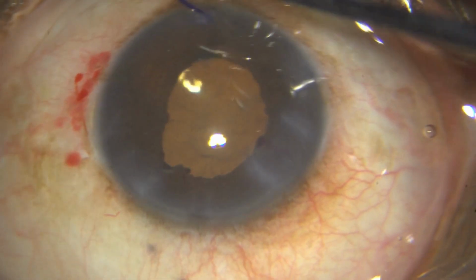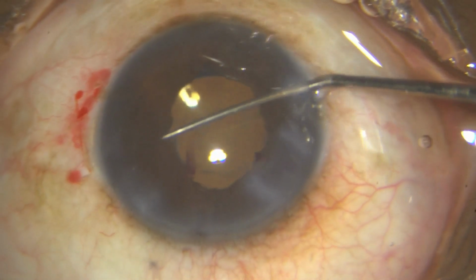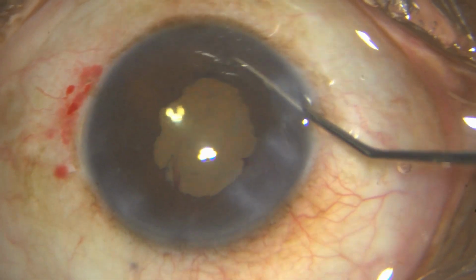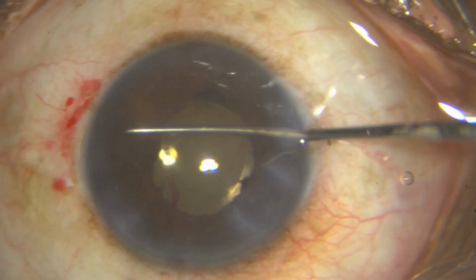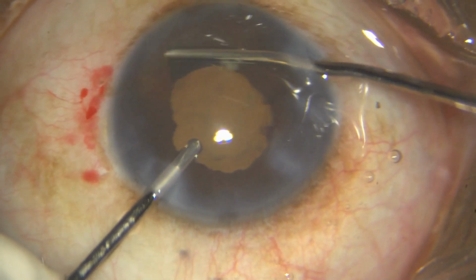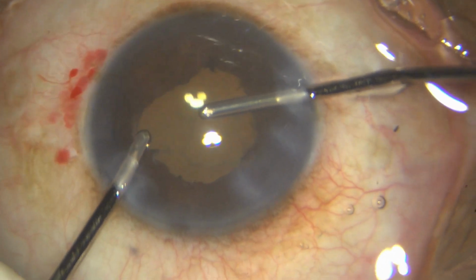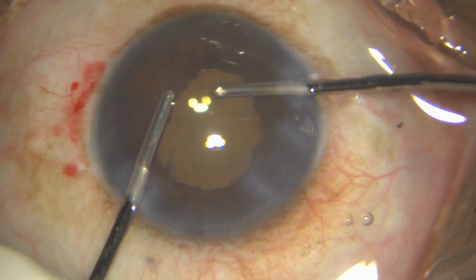See, all these uveitic cataracts will have a very floppy iris. So it's very easy for this iris to go and get incarcerated into one of your paracenteses. So I'm just releasing all those, and you can see how floppy that iris is. Just any slight aspiration and it just rushes into the port. So I'm just holding that back and trying to aspirate all the HPMC out. I can't leave any HPMC either.